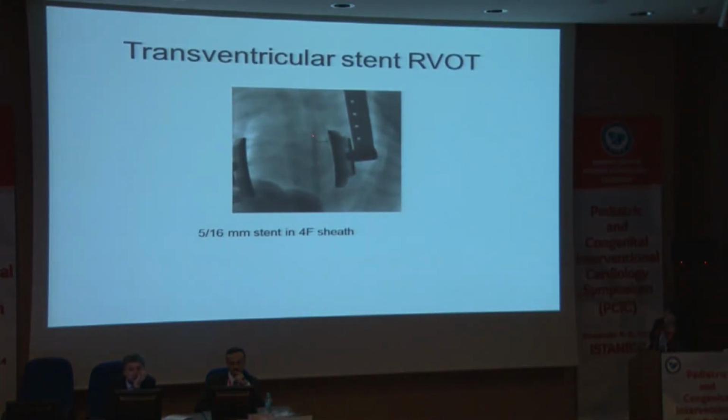here you can see the stent over the balloon, and here we can use again, obviously we also do contrast injections via the sheath, but we can use the clip as reference for positioning our stent. Again, these are often types of bailout procedures where the alternatives have a higher risk, and we have seen in these patients adequate growth of pulmonary arteries with the possibility of either enlarging these stents or having a complete correction after a few months if they have a better weight or better general condition.